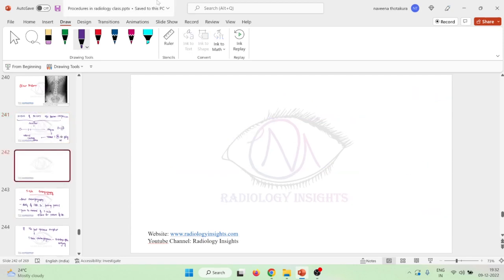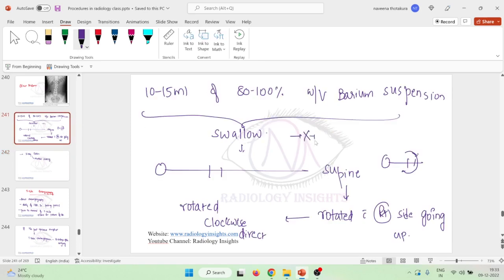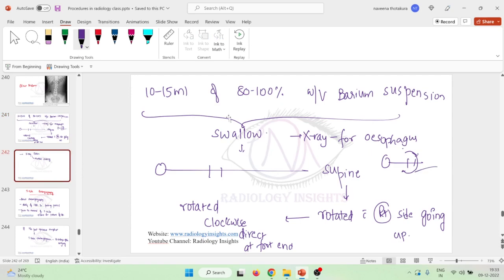Next, we will have to take an X-ray, and you should see whether the mucosal coating is good or not. Once he swallows, we will have to take an X-ray to visualize the esophagus. For visualizing the esophagus, we should take an X-ray here, and followed by it, once we rotate the patient clockwise, as seen at the foot end, as if the patient is looking clockwise, we take an X-ray again.